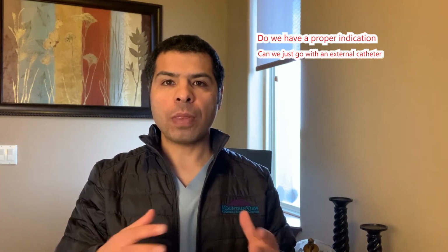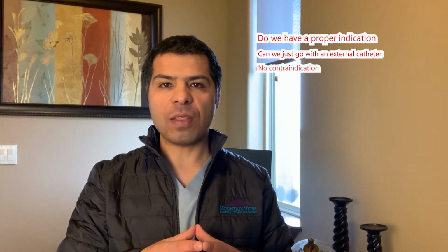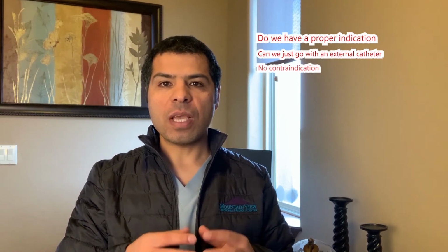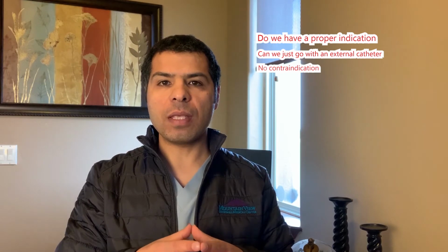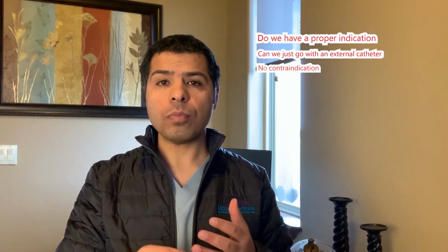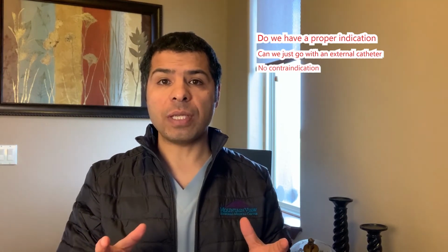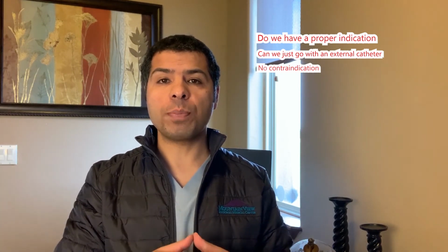The third thing, make sure that we don't have a contraindication to place that catheter. Placing urethral catheters is contraindicated in urethral injuries. At any point, if you see blood at the meatus, please do not place a urethral catheter, and call urology. If there is any suspicion at any point of urethral injury that comes with pelvic traumas, even if you have a very low suspicion, please call urology.